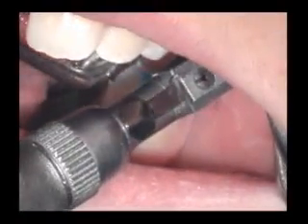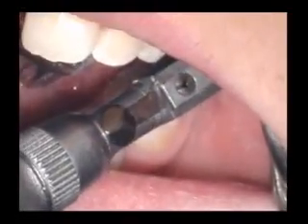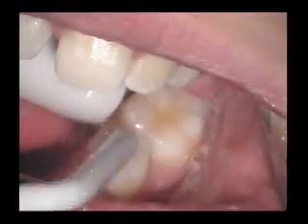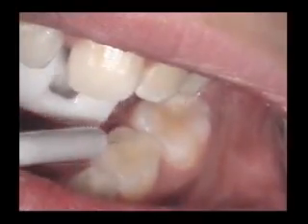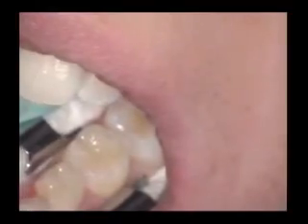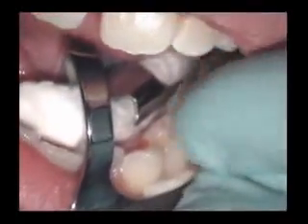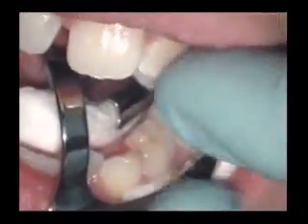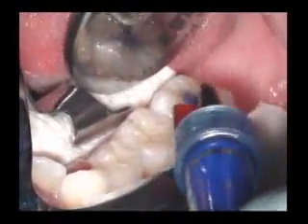Here is the 5-step sealant application procedure shown again on a patient. Pumice polish the occlusal surface. The tooth is then rinsed thoroughly and dried. Appropriate cotton roll isolation provides the same protection as that provided by rubber dam. Use of a triangular-shaped absorbent buccal shield provides additional protection when placed over the parotid papilla and salivary duct in the cheek. Etch the tooth for 15 seconds.